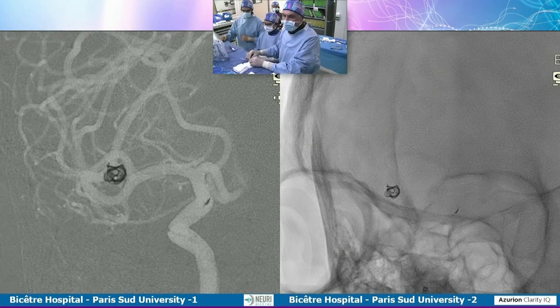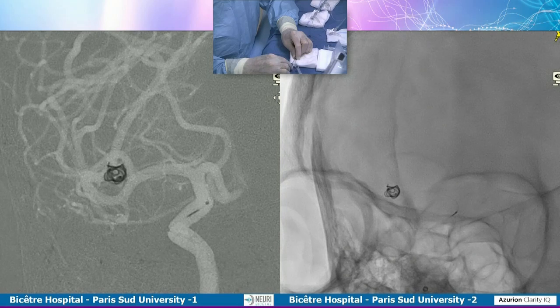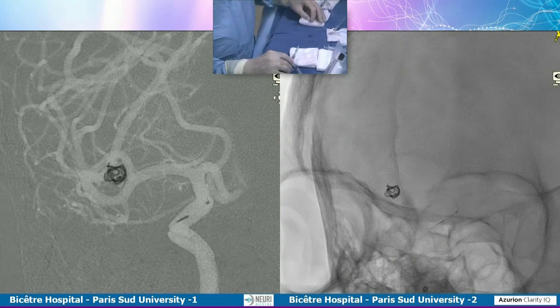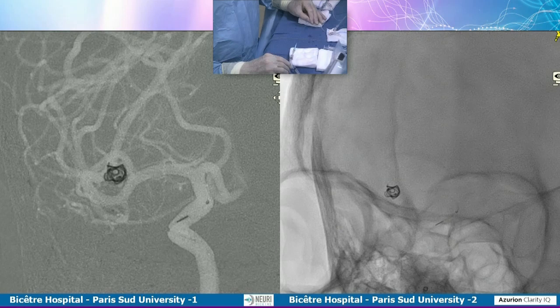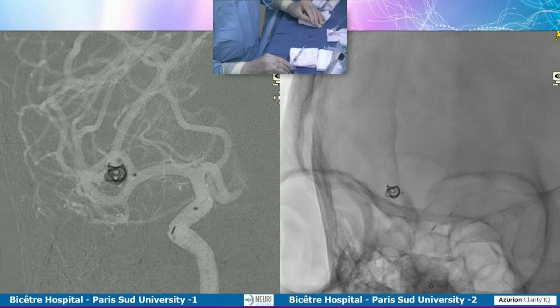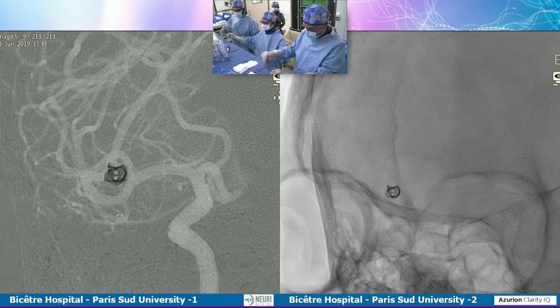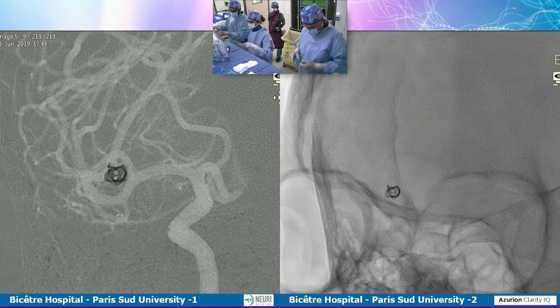We frequently use this digital magnification, which is very useful. So keep in mind how useful this magnification is. This aneurysm measures 6 millimeters. And when you display that in the Louvre, the height here is 6 or 7 meters. So you see that the quality of the picture allows a very nice enlargement.